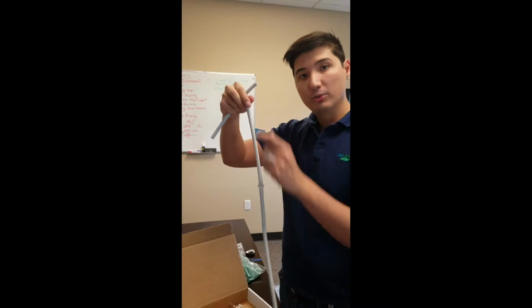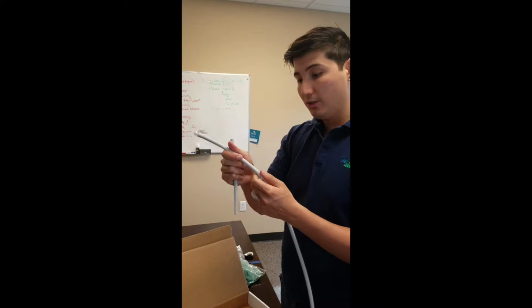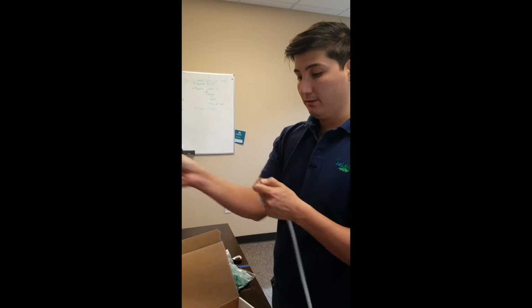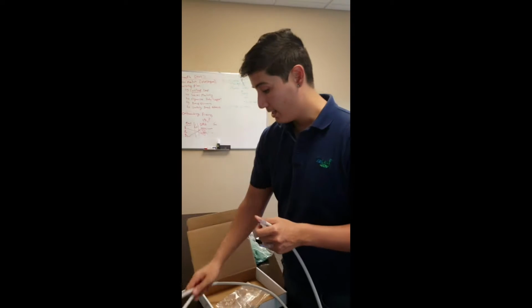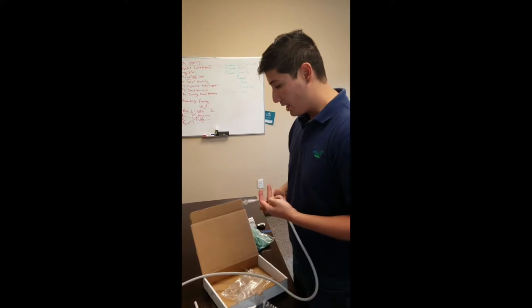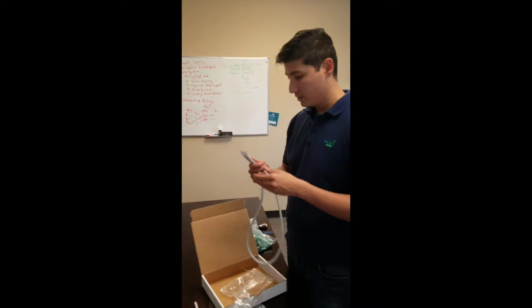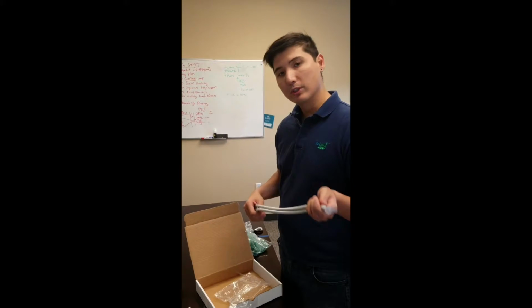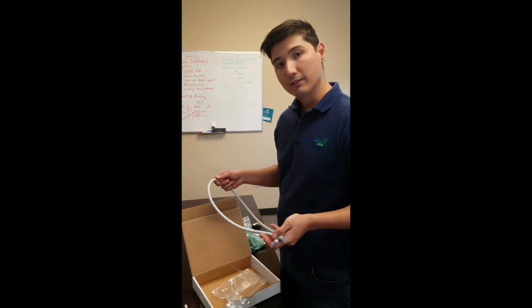And then you can wipe down the hose with a cavi wipe. If this gets dirty, because this is near the patient too, you can take this out too and autoclave it too. So they give you an extra hose to do that. But they give you enough stuff here to kind of cycle through 8 patients a day. So it's pretty cool. So what we're going to do now is we're going to go in the dental clinic and actually plug this in and kind of go from there.